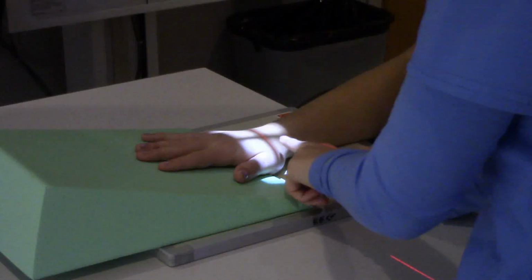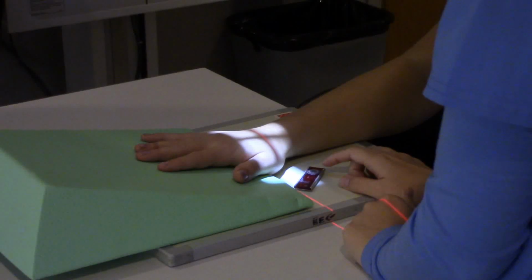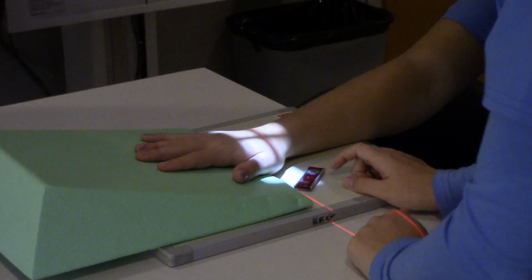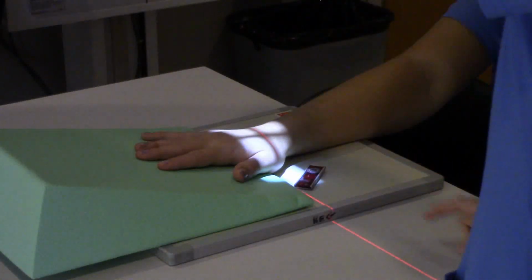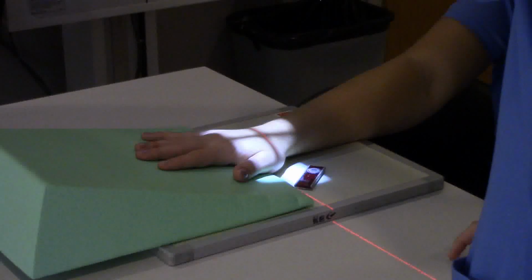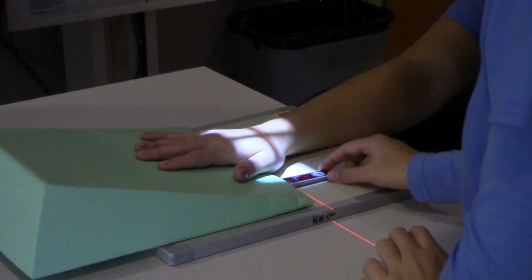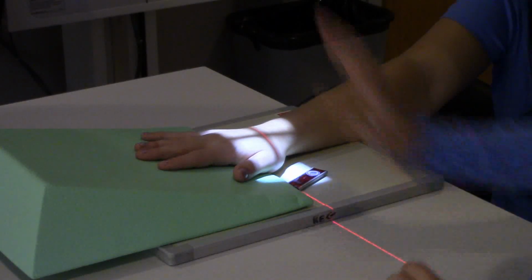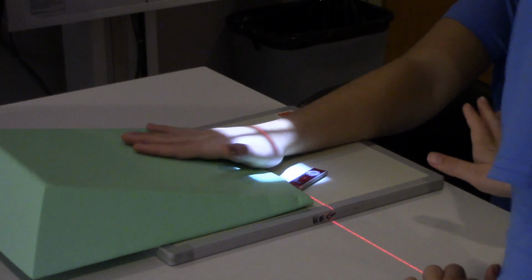Okay, now the book says we're supposed to be 2 centimeters distal and 2 centimeters, I guess, medial to the styloid process of the radius. But to me it's easier just to think a half inch and a half inch. Is this one okay with the ulnar deviation? This is going to have ulnar deviation if the patient can tolerate it.